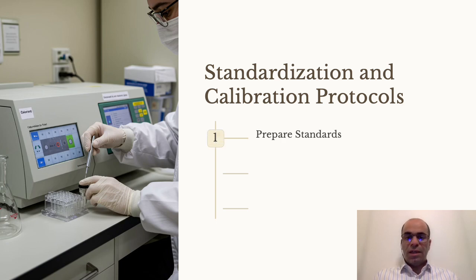Number one is preparing standards. Preparing is about creating a series of calibrators with known concentrations that span the expected range of patient samples. Use certified reference materials, especially when available, to ensure traceability to international standards.